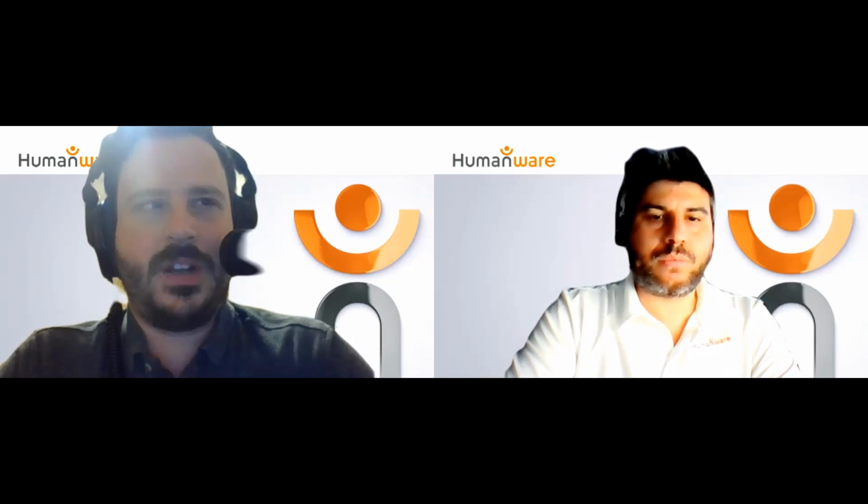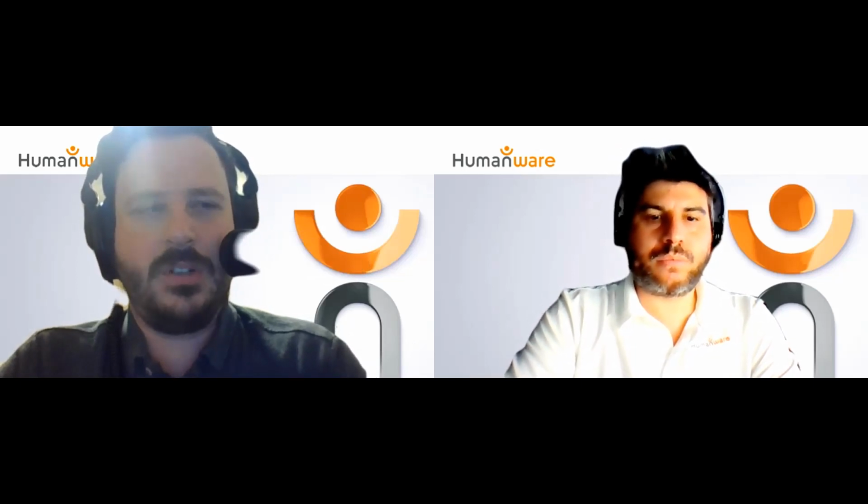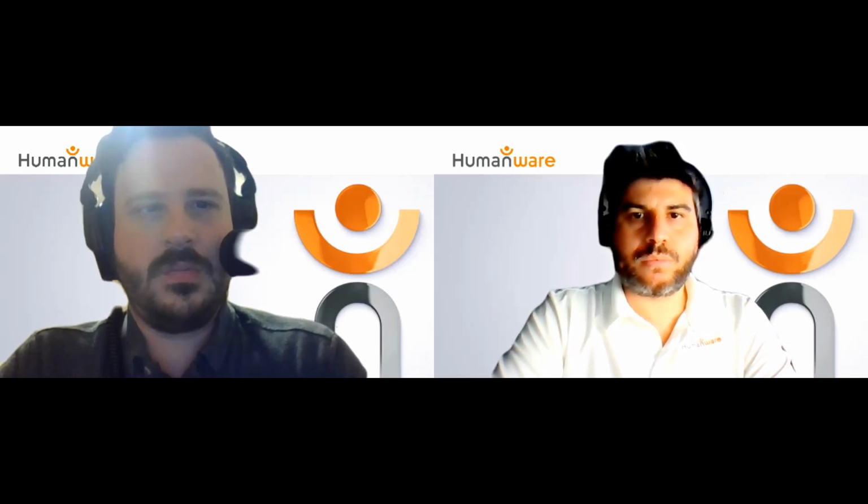Now, what I am going to do is I'm going to share my screen, and once again I'm going to share my sound. Bear with me one moment while I do this. Screen. All right, we're going to share sound.